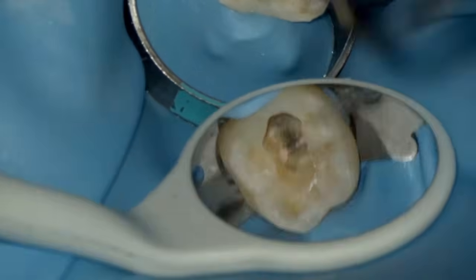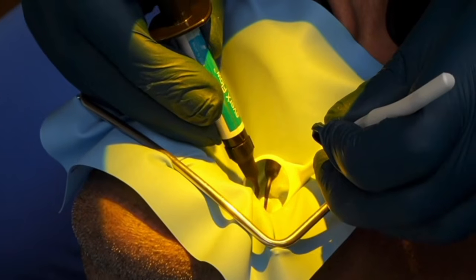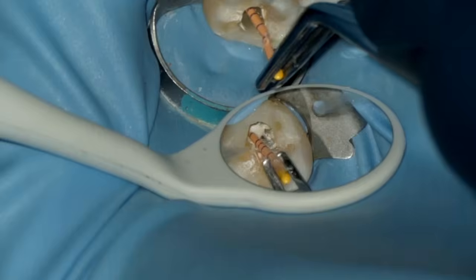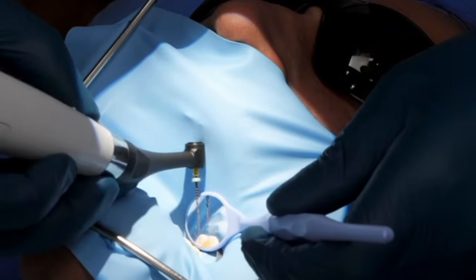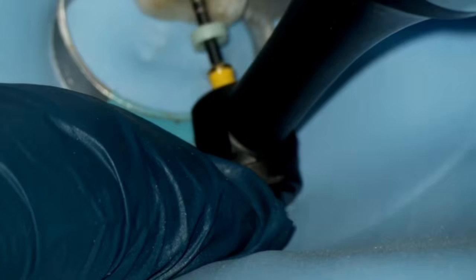The technique I used was single cone bioceramic. The canals were very thin, very narrow, and as such, I didn't want to introduce significant force within the root canal system. Also, they were quite round. As they were round, I was happy to use a single cone bioceramic technique. As you saw in the videos, we injected a bioceramic sealer within the canal without letting the tip bind, and then subsequently placed the GP cones slowly to working length.